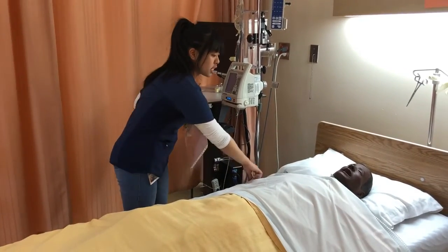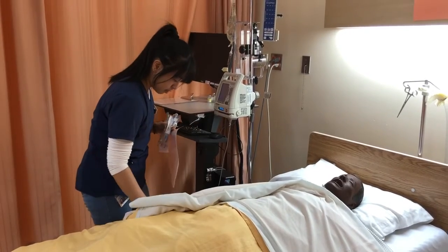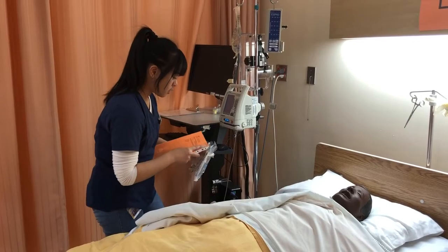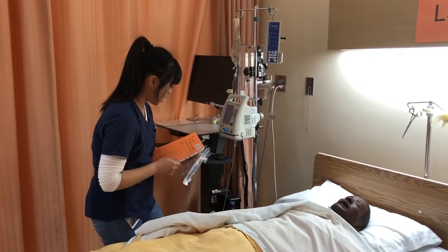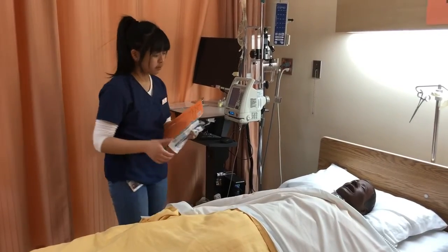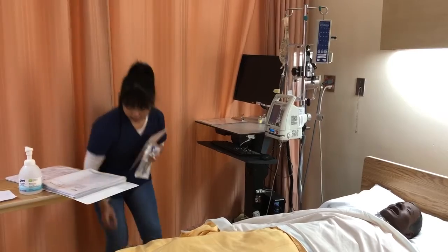But before I do that, I'm just gonna check your wristband here. So can you give me your full name? Okay. And I'm just checking that with the MAR as well. So, Frida Fritz, okay, and when's your birthday? Okay, do you have any allergies? No? Okay, that's what we have here as well. So, I'm just gonna do my third check. And I have my tubing here.